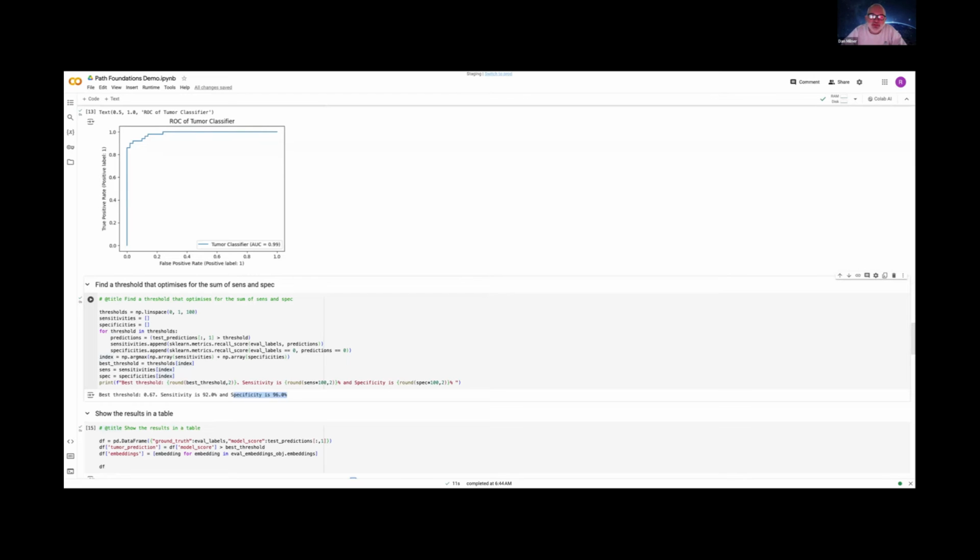What would happen, or how would you structure it differently if you wanted to feed it all normal tissue, but teach it to recognize what that tissue was? Like, so let's say you wanted to feed it 100 sections of lung, 100 sections of normal breast, and the outcome is you wanted the AI output to be, this is lung tissue, this is breast tissue. I mean, you may have already done that, but is it the same tool, or is it a different way you would have to approach that? Because you would want an all for one. You give it an image and then it tells you the tissue.